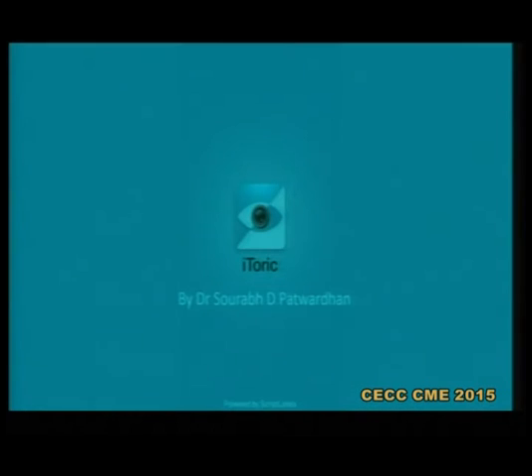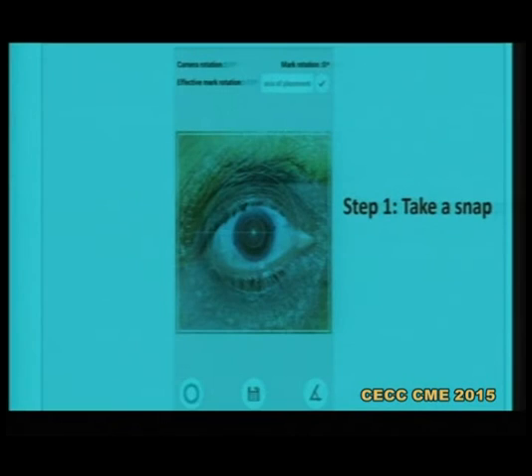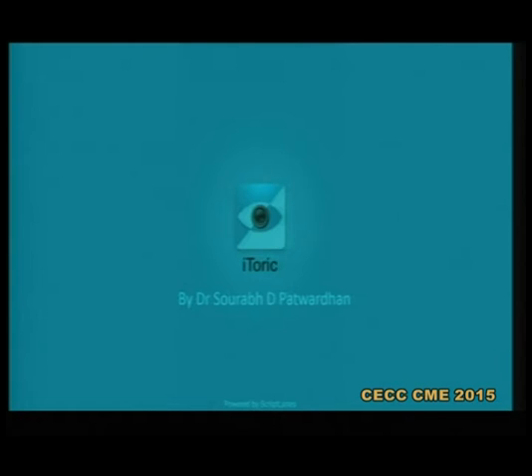Let's go through a small video. Here is a small video which I will show you how to use this Android Toric application.